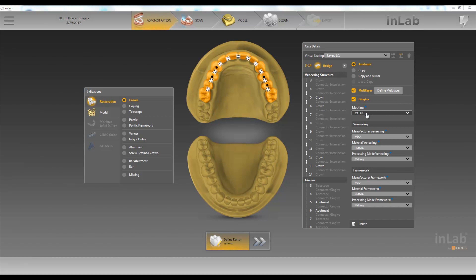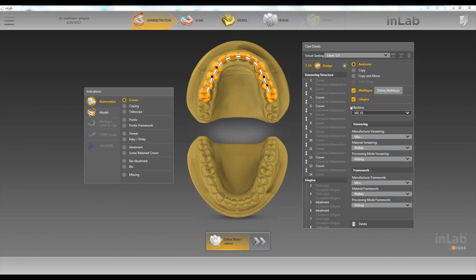Hello, this is Jay Black with Tekken 2. In this video we're going to go over the new multi-layer gingiva function in the NLAB 18 software.